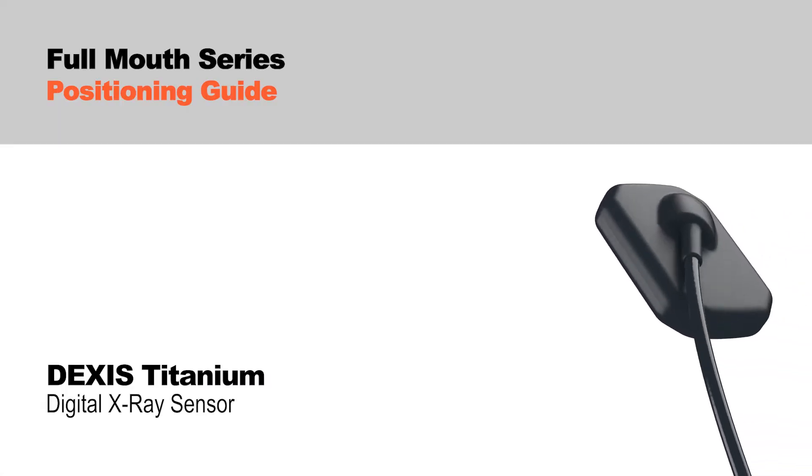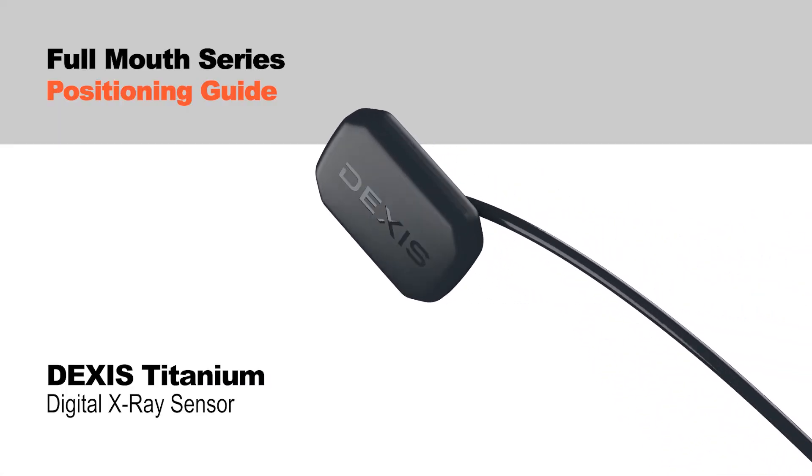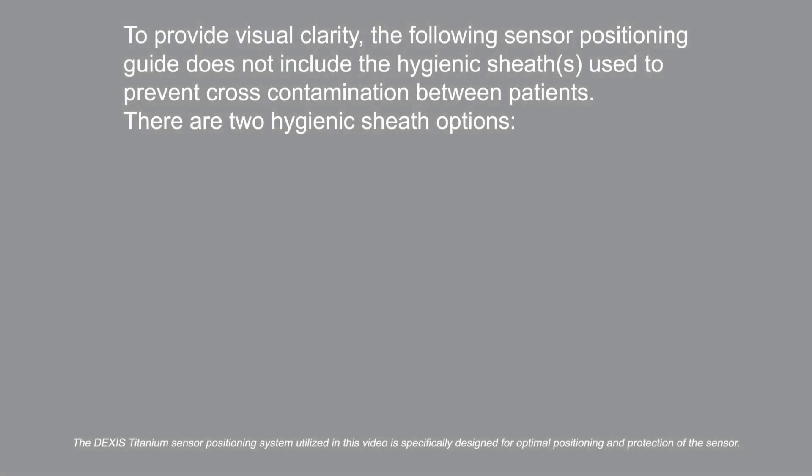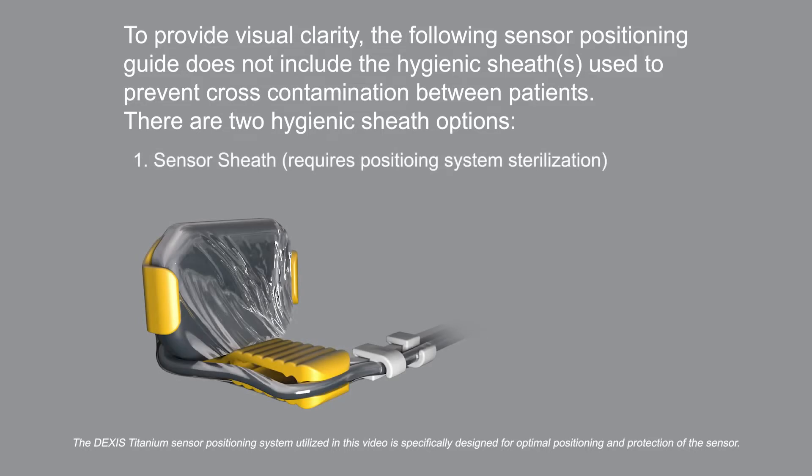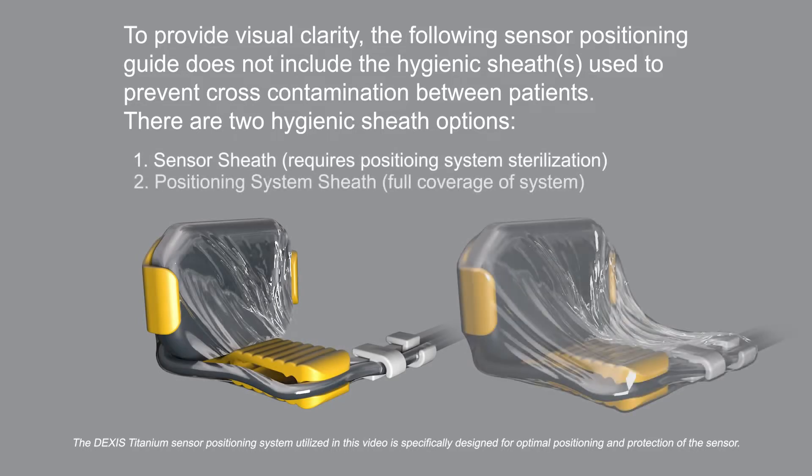Welcome to a guided tour of a full mouth series using the DEXUS titanium sensor. For the purpose of this demonstration, the hygienic barrier has been omitted from this animated video. To help prevent cross-contamination between patients, place a new hygienic barrier on the sensor for each new patient.